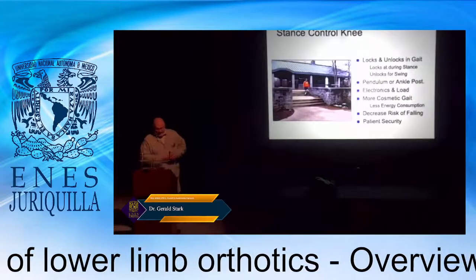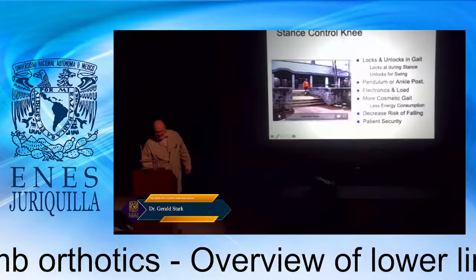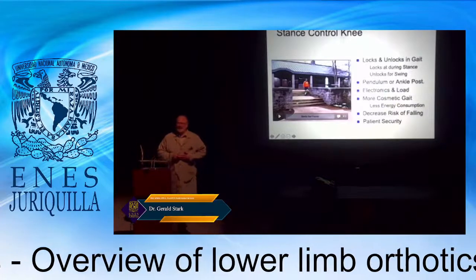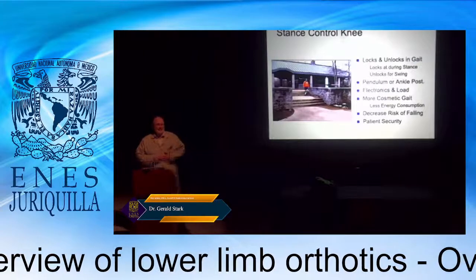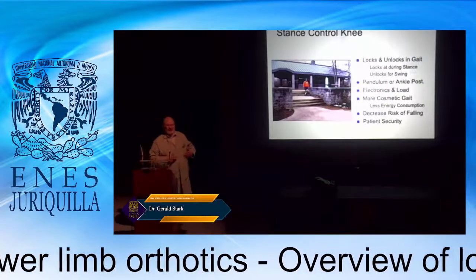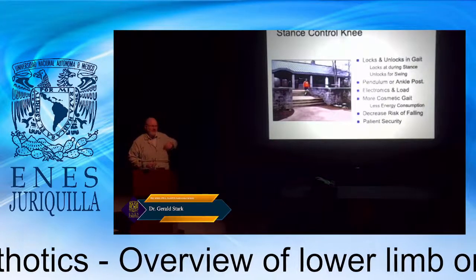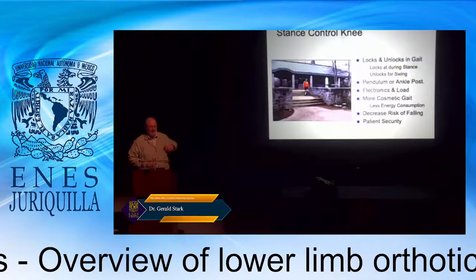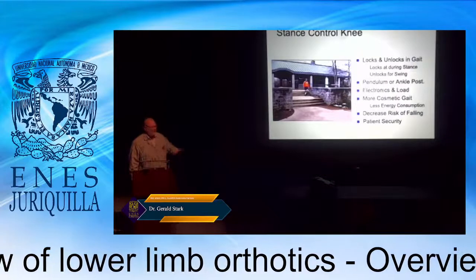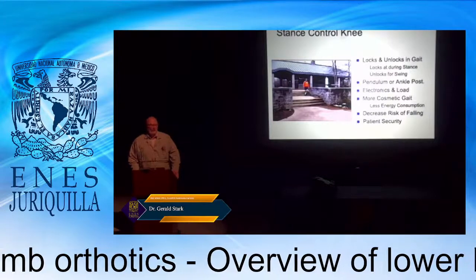Now, the new thing is these, let's see if this will play. No, are these stance control devices that lock and unlock. I think it was around the 2000s. I had a therapist ask me, could we just lock the knee during stance and unlock during swing? And at the time, we didn't really have that. But by 2005, there were actually 4 different designs that used mechanical systems. The downside is those things worked really well for surface terrain, but when you walked up slopes or down slopes, they didn't work as well.